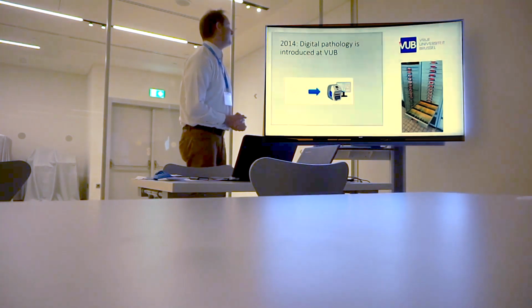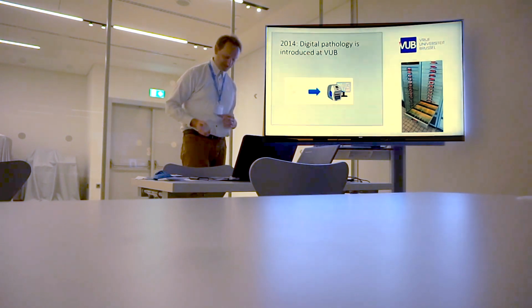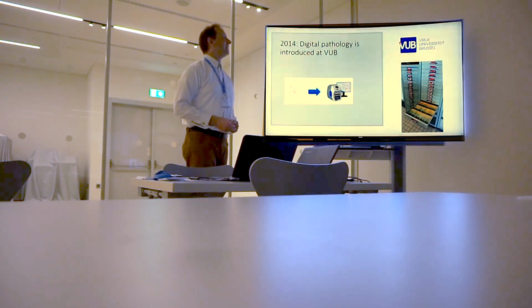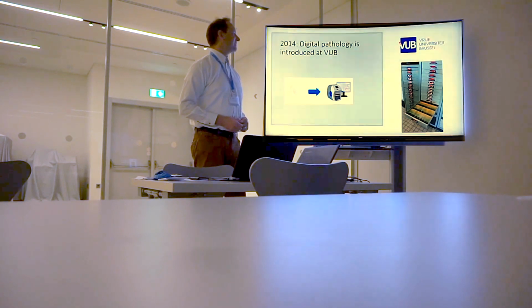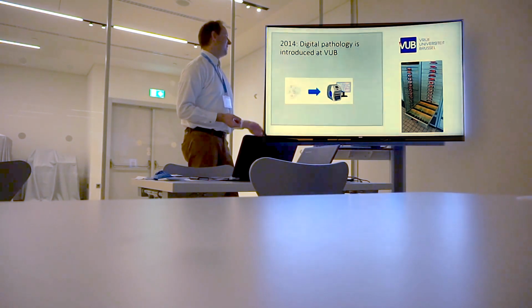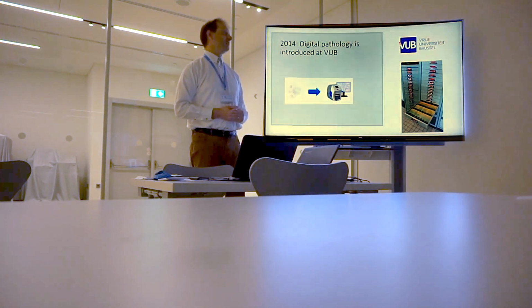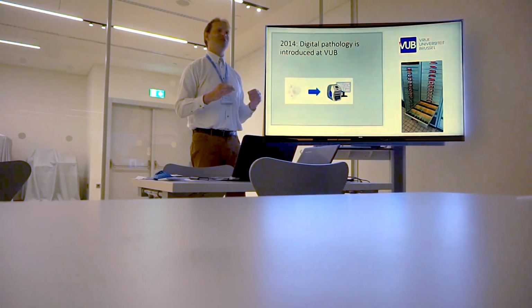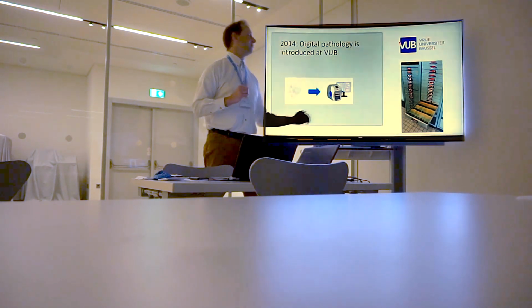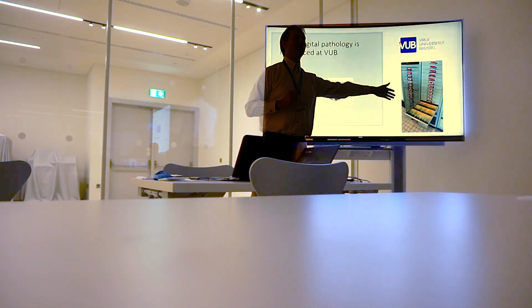In 2014, I also joined the Vrije Universiteit Brussel, which is my affiliation today. At the University of Brussels at the time, you start very small, of course, very humble. You start with slides, you put them in the scanner, you have digital slides. The initial use case for digital pathology in Brussels was a biobank. And this is recognizable from any institute around the world, of course.